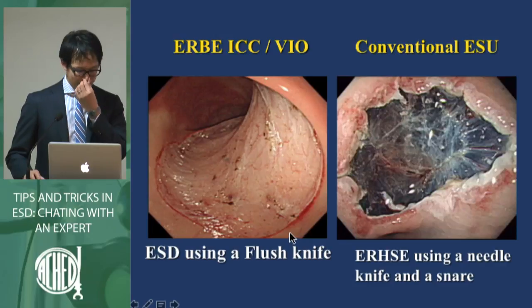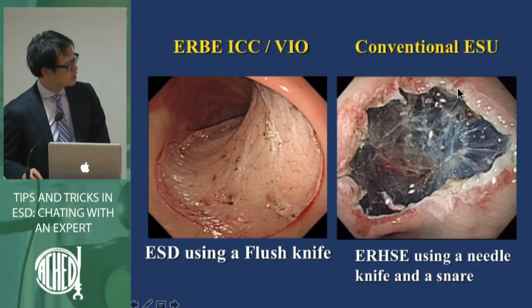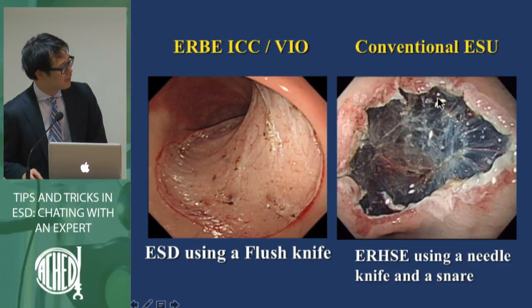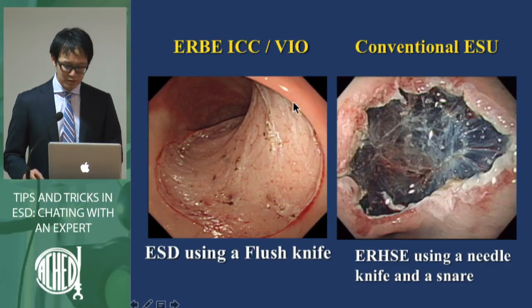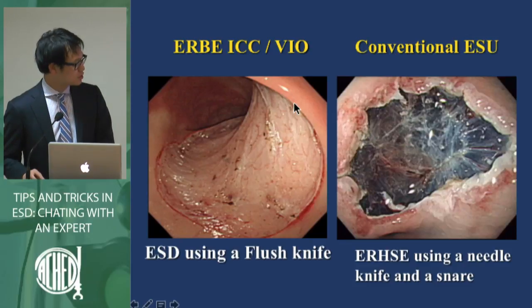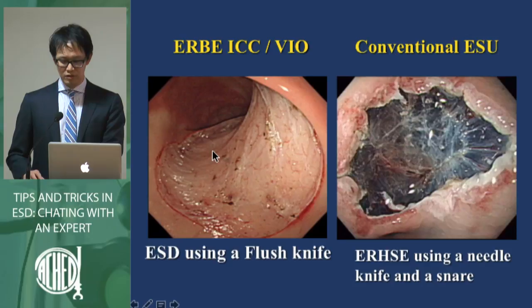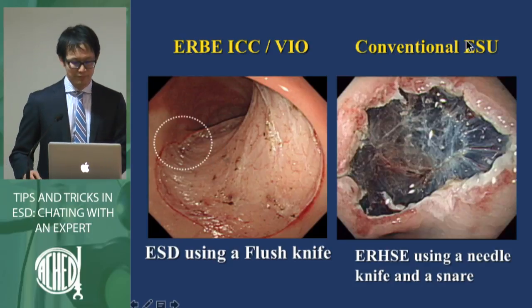This is using the ICC. Here is ESD using a flush knife. Before, with conventional ESUs, the edge was very rough. But now the microprocessor controls the cutting edge, so it is more beautiful compared with the conventional ESU.